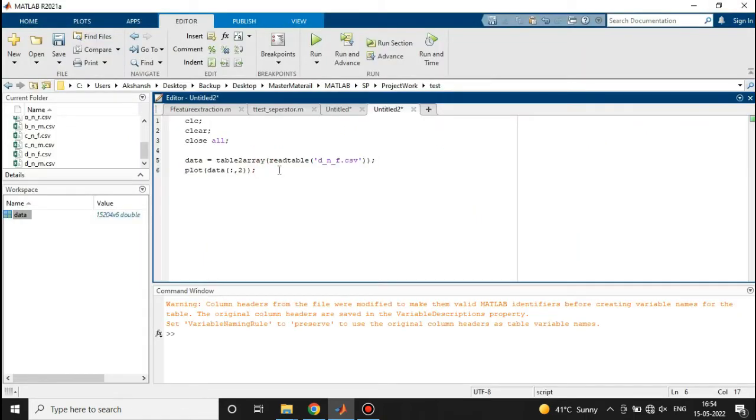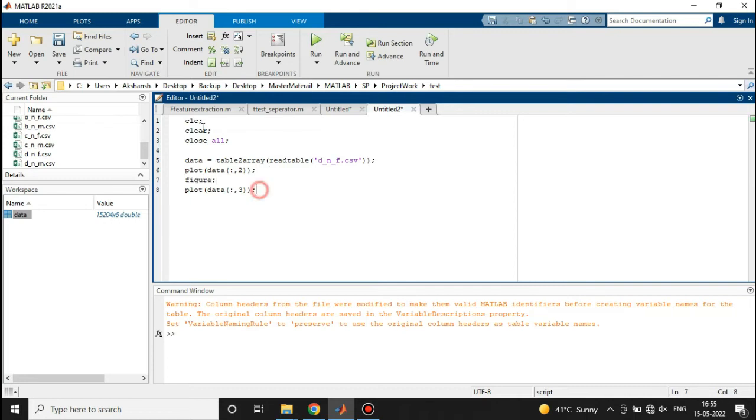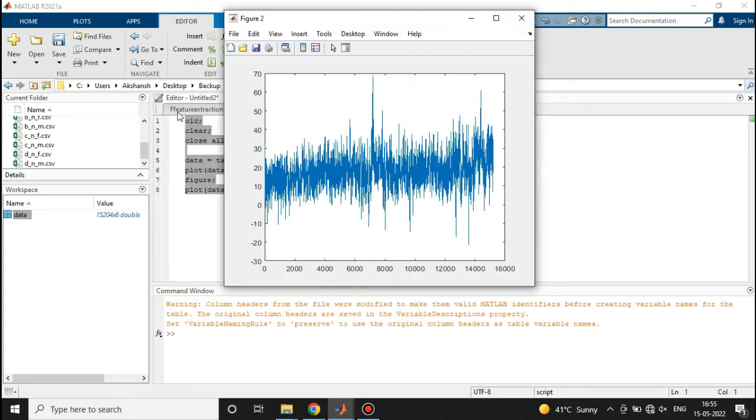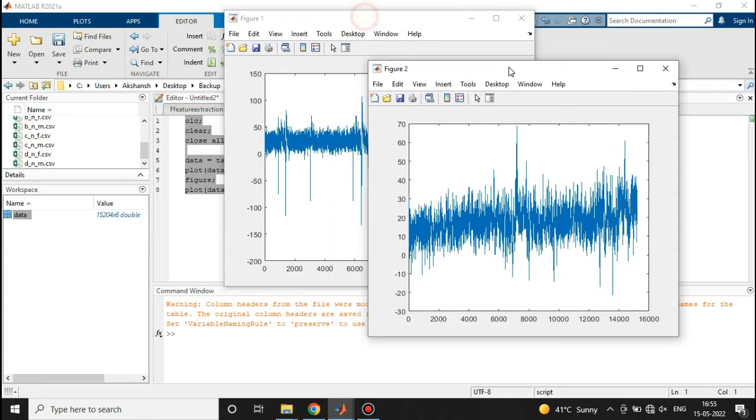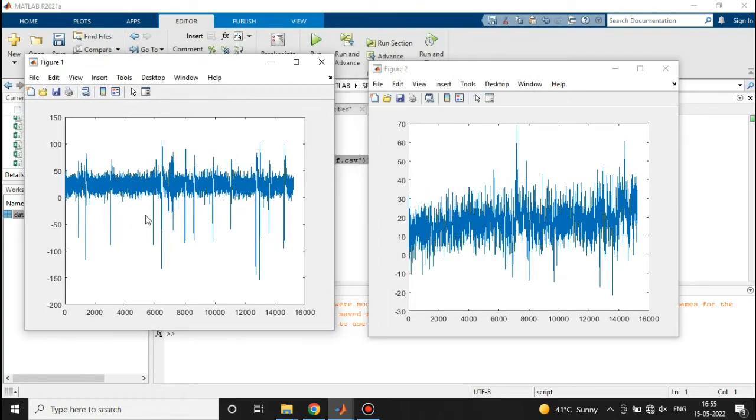Now let's plot another column also. I'm taking all rows, then I'm taking the third column. We are plotting another plot, so we have to write figure here. Now here we go, we have two different figures. This one was representing TP9, this next one is representing AF7.